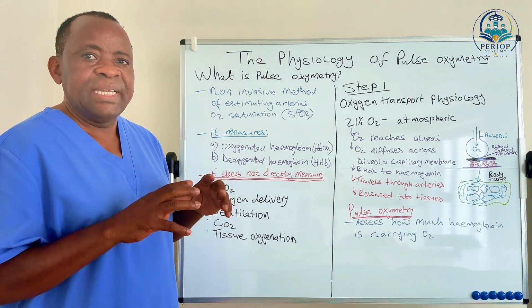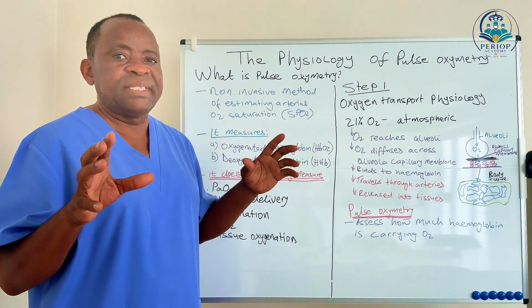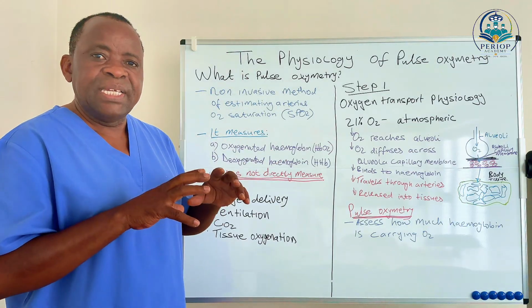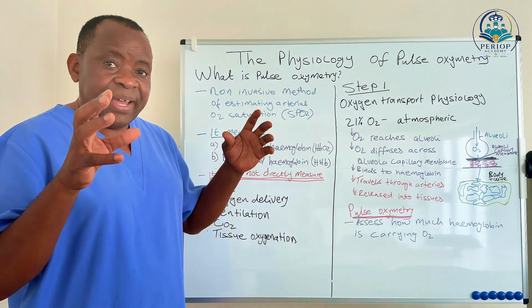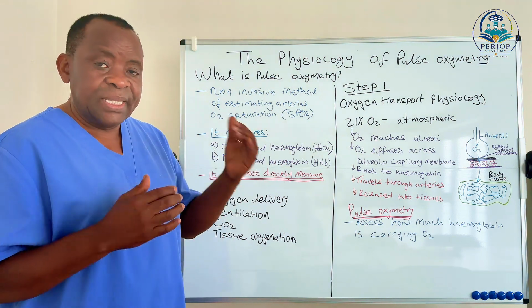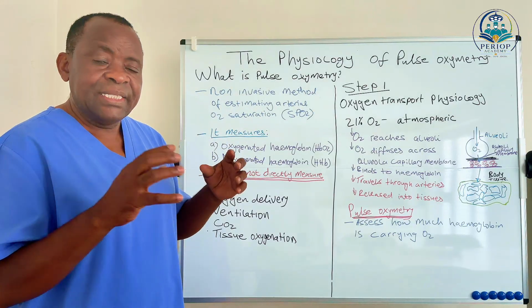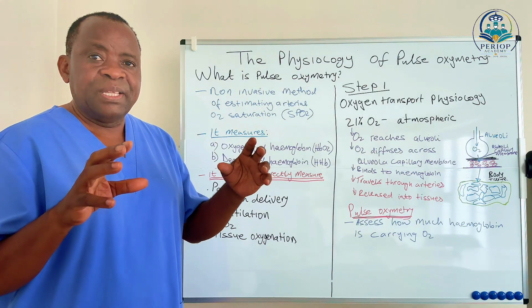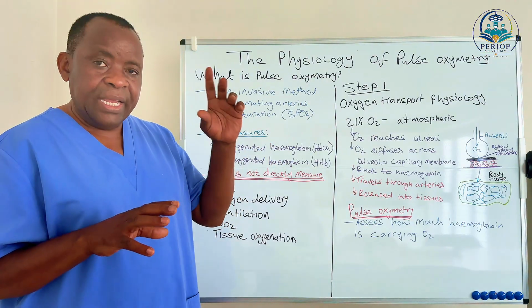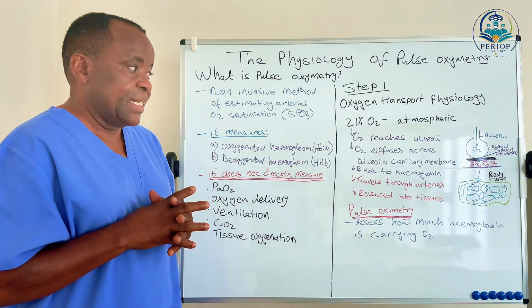However, this information can be clinically applied wherever the pulse oximeter is being used, be it in the ward, in the community, at home, wherever. The information you will receive here is equally the same. But in this case, I'm looking at it as we clinicians look after the patient in the anesthetic, recovery, and back in the ward. These are the scenarios I've considered.